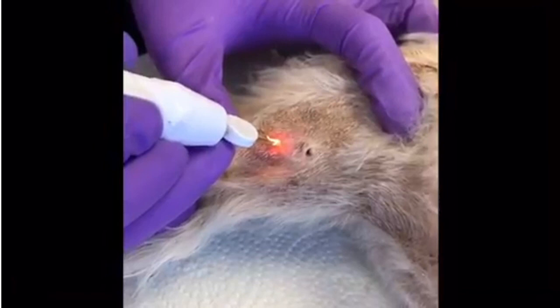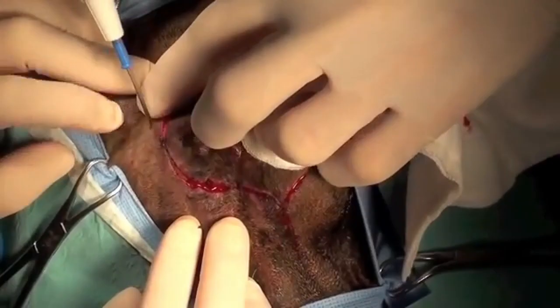It's actually the capsule of the cyst. Remember, a cyst would have a capsule inside. It's like a layer of fibrous tissue, and you need to remove that to prevent the recurrence of the cyst. And there's bleeding because you didn't use a monopolar for that. And that's it. And it's done. See? No more bleeding. Magic, I call that.